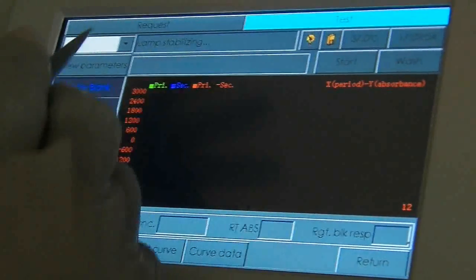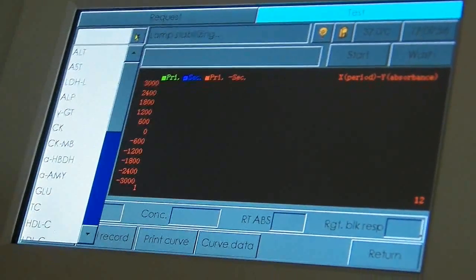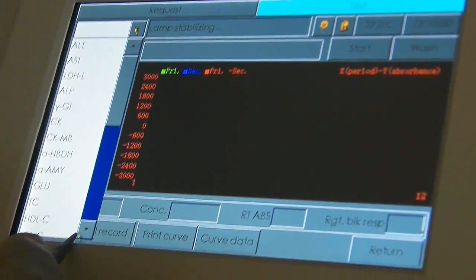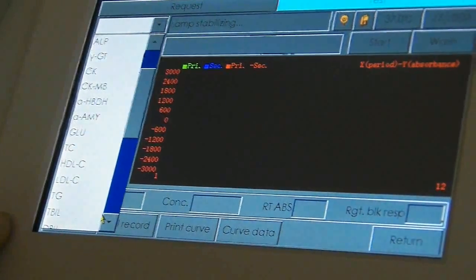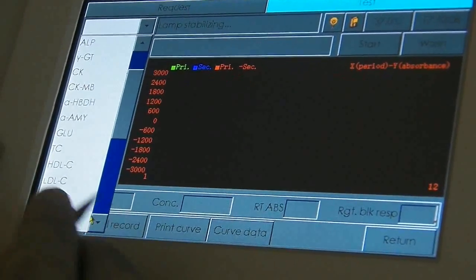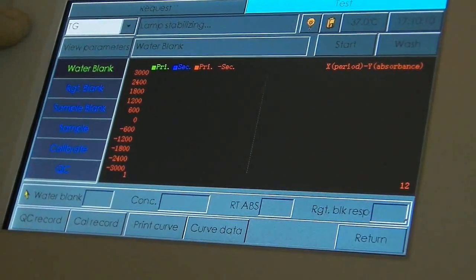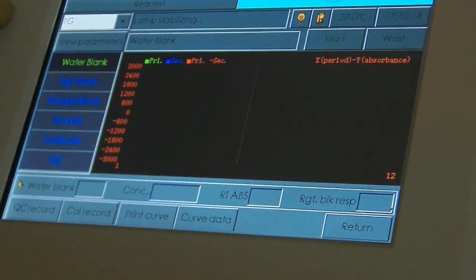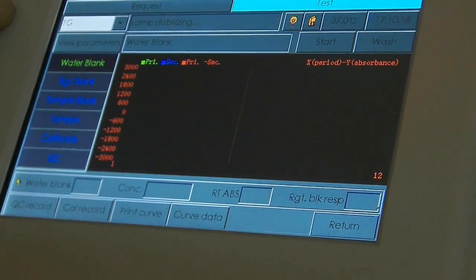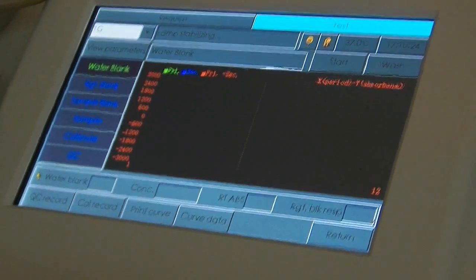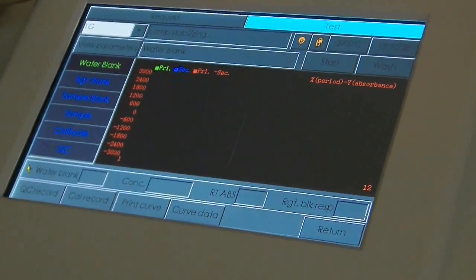While the lamp is stabilizing, it's okay to choose a parameter. We're going to run triglycerides. You can see the parameter here — TG. We select TG, triglycerides. The lamp is still stabilizing, so we'll wait. We'll continue with this video as soon as the lamp is stable and our incubation period is done.